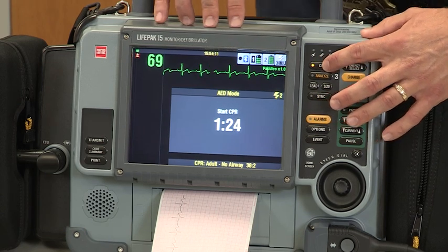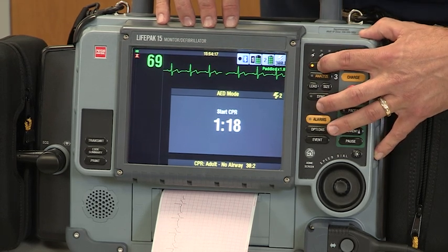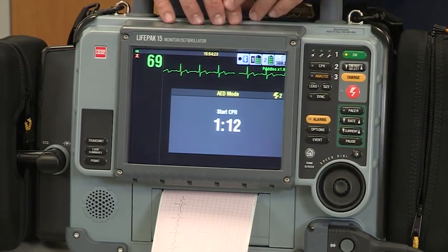Ventilate. Again, just as review, in the AED mode, the CPR metronome and the voice prompts are going to come up for ventilation. To get rid of that, just simply push the CPR button. You don't have to use the selector dial to stop the metronome.